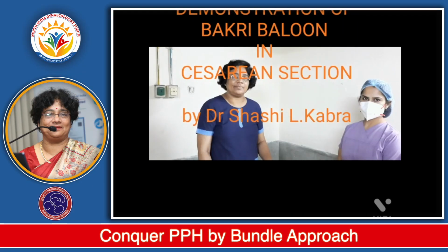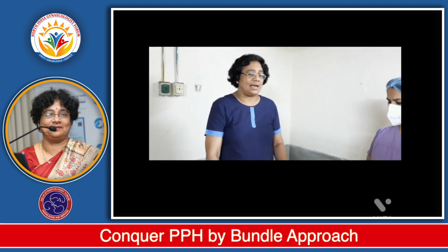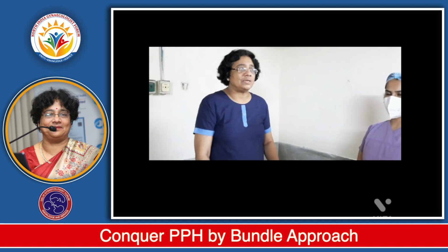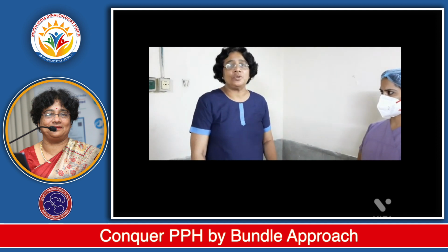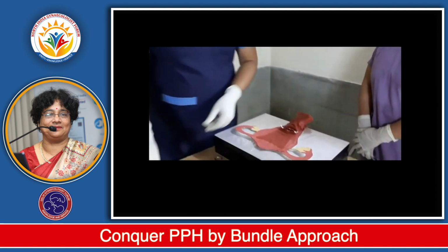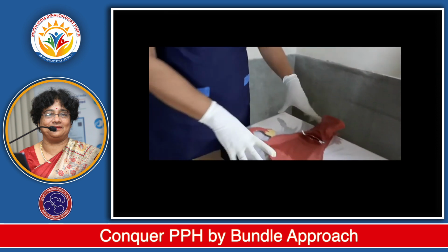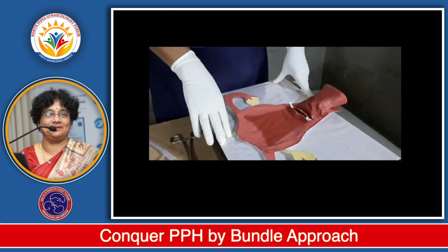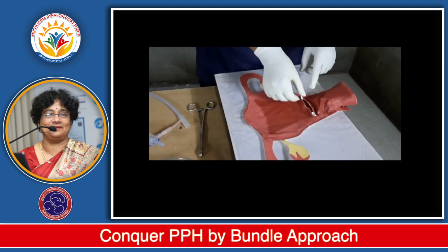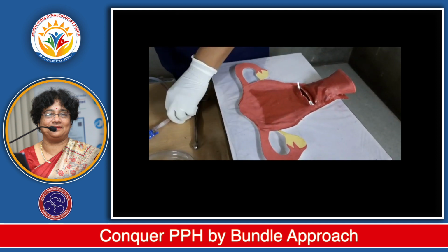I am just showing you the method of insertion of Bakri balloon in cesarean section. So hello everyone, I have already demonstrated how to insert the Bakri balloon in the uterus after a vaginal delivery. Now I am showing you how to insert the Bakri balloon if we are doing a cesarean section. So this is the balloon, this is inflation channel, this is outflow channel, and this is a model of the uterus which I have made myself. Now this is representing the cesarean wound.